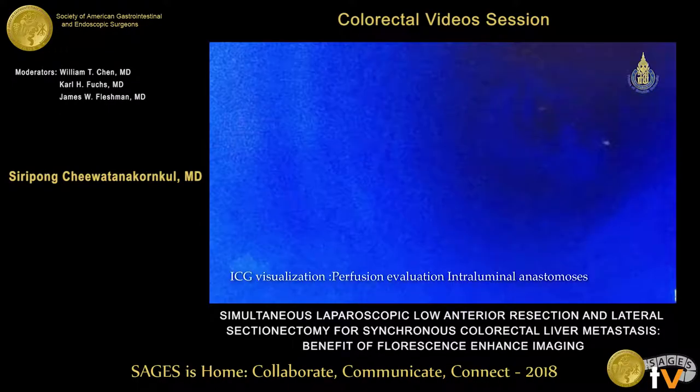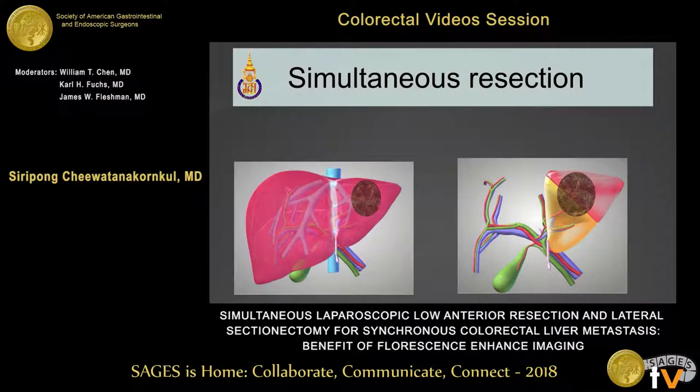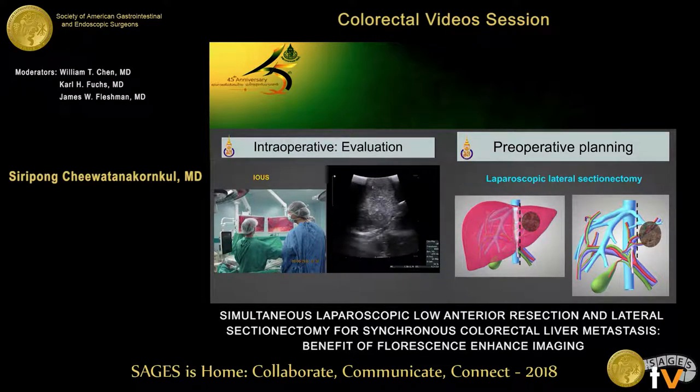But be careful — the ICG signal disappears very quickly, in about 30 seconds. Now we move to the lateral dissection of the liver.